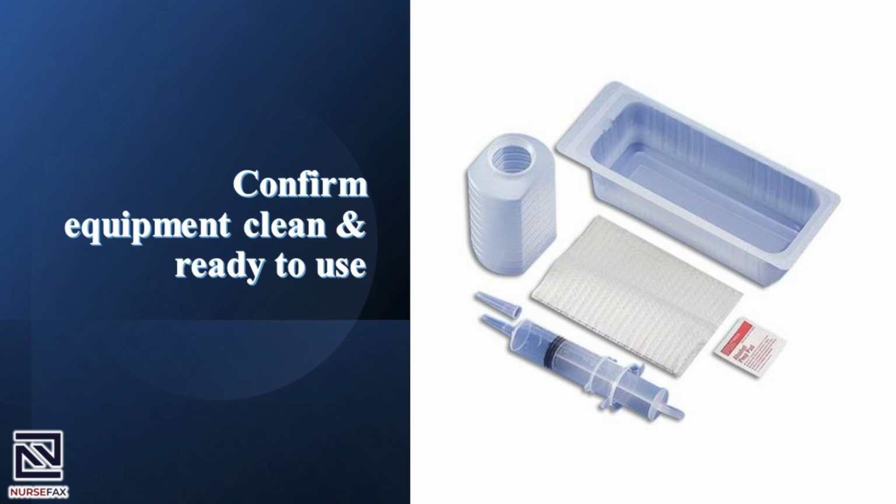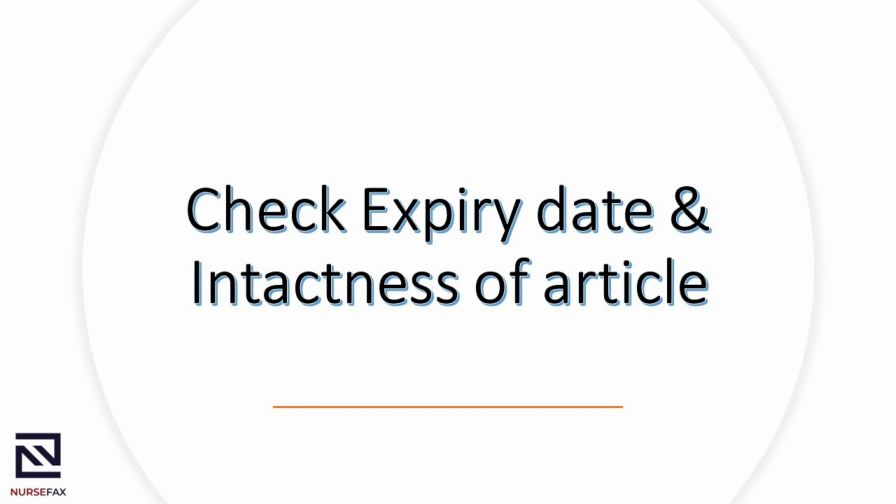Confirm whether the equipment is clean and ready to use. Clean if needed. Assemble equipment after confirming expiry and check whether the packages are intact. Prescription and patient ID check. Return to the patient and check the prescription.